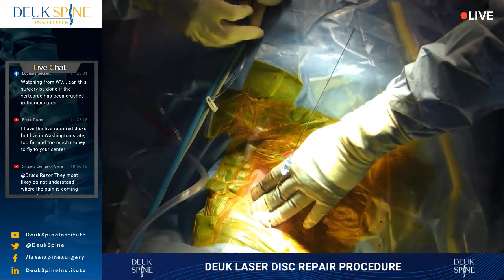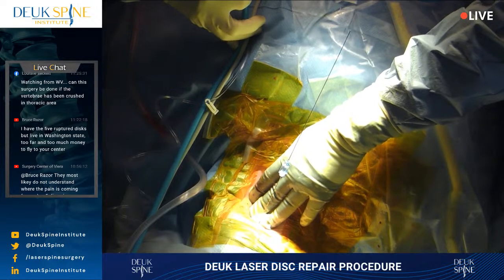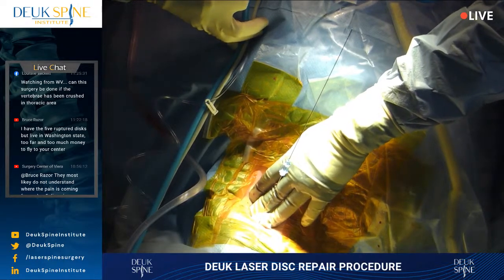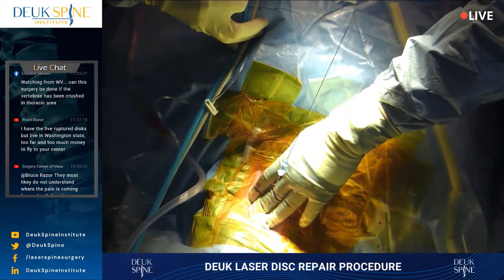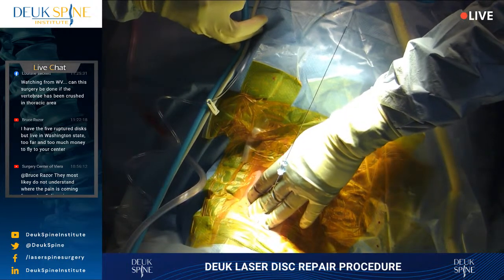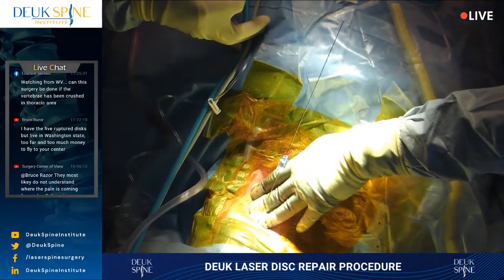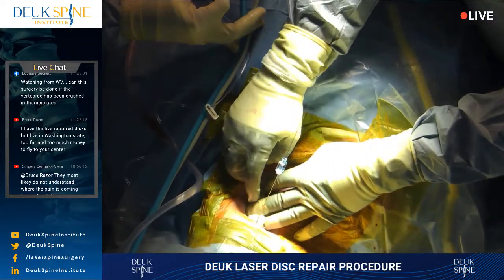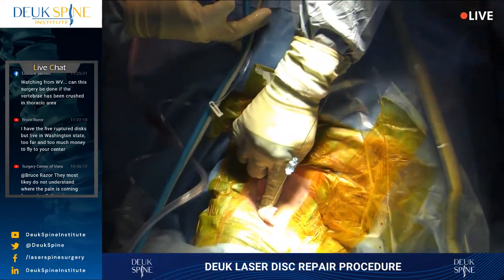Basically, there's going to be some venous bleeding, and venous bleeding is at about 10 millimeters of mercury pressure, which is not that much. So you just have to hold it for a minute, and then any veins that are torn and bleeding will stop bleeding. We've lost probably 1 milliliter of blood, about 20 drops of blood so far. We're not going to lose much more than that for this surgery. It's pretty much a bloodless surgery.